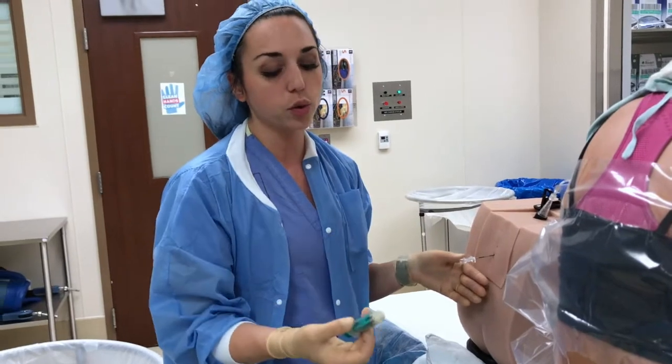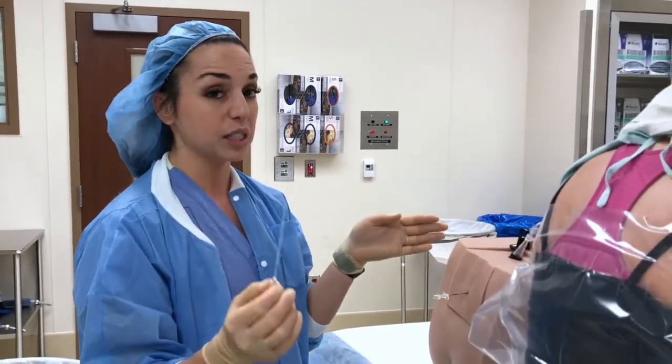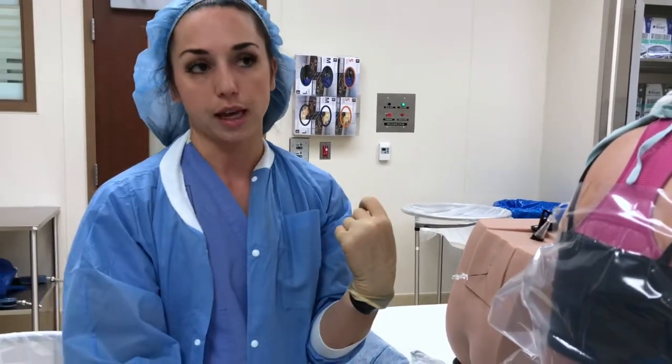So you'll remove your plunger, and then you'll pick up your spinal. So for the combined spinal epidural, remember, we've hit the epidural space. Now we're going to do a spinal dose with the spinal needle. If this was an epidural, we would stop and start threading the epidural catheter.